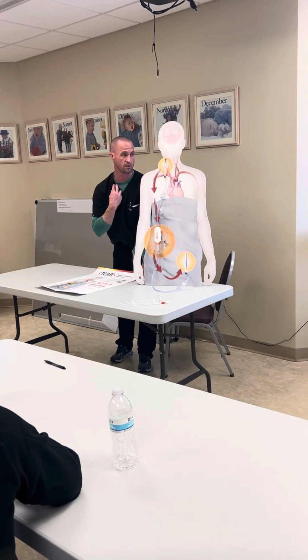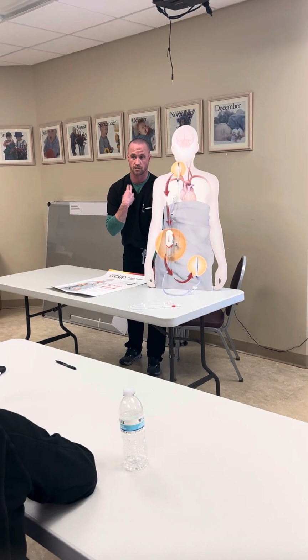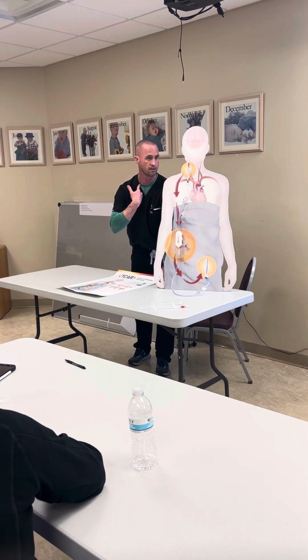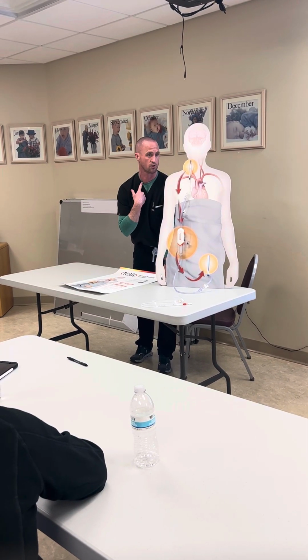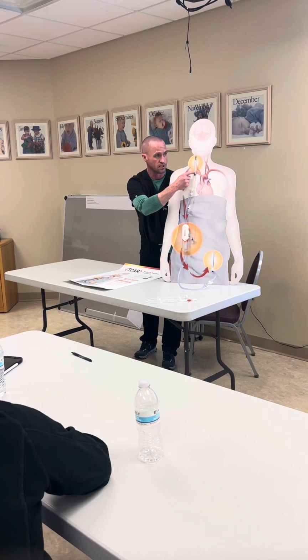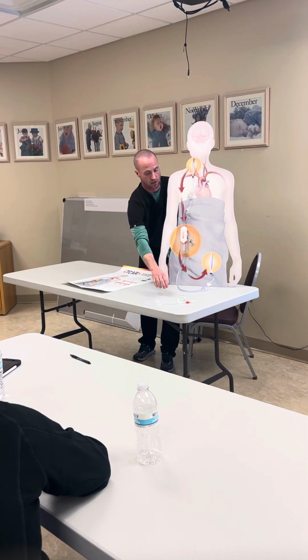I mean, when I say above it, when we're looking at CTs, we're marking our access just a centimeter above, if that. You're exposing the carotid is all you're doing. It's a small window just so you can visualize it. Put an 8-French sheath in the carotid, and we provide everything specific to that.